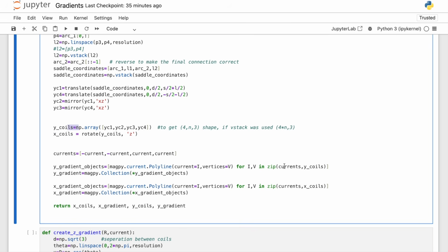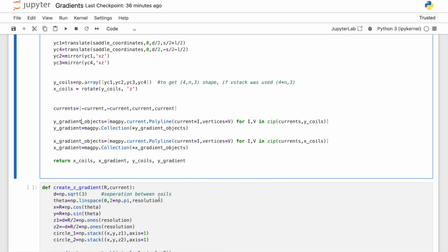So here I zip the currents and y coils to just iterate over Magpy polyline object creation more effectively. Otherwise, we can just have 4 lines for each object, for each saddle. And then the same thing is done for x gradient. And after that, we get the y gradient Magpy object, x gradient Magpy object, x coils, which is the coordinates, and y coils. So I return 4 of them because we'll need the Magpy objects, the gradients, for analysis, and we'll need the coils for visualization.